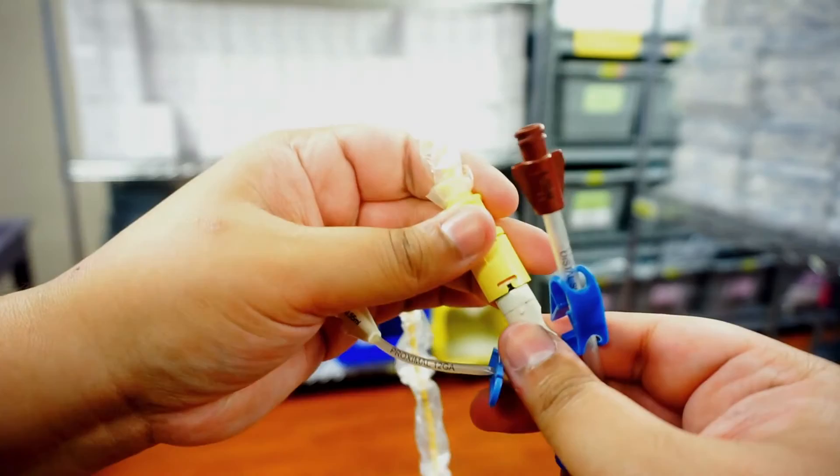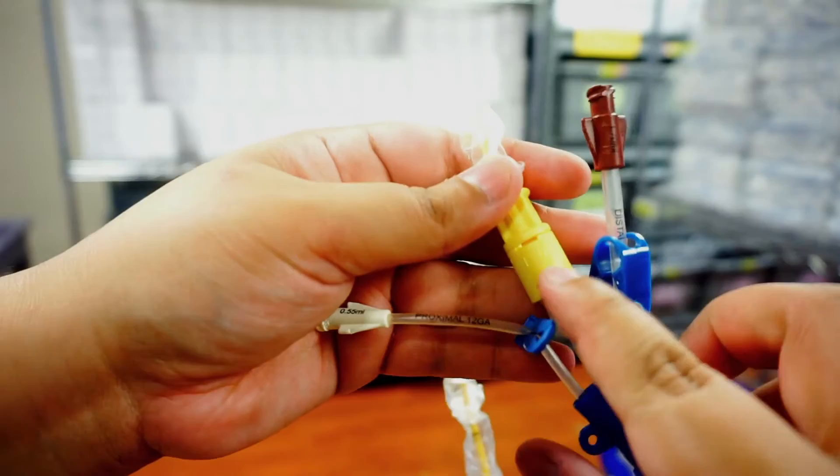I'm going to go ahead and lock it back in place. So that's an important thing. If this isn't locked in place, then your Swan could potentially come out.